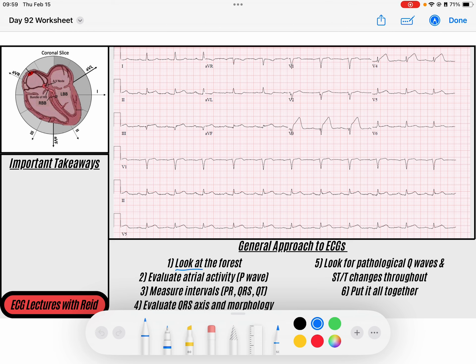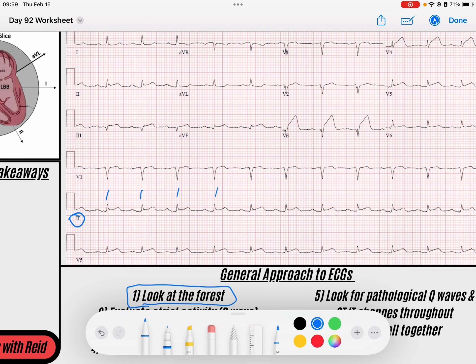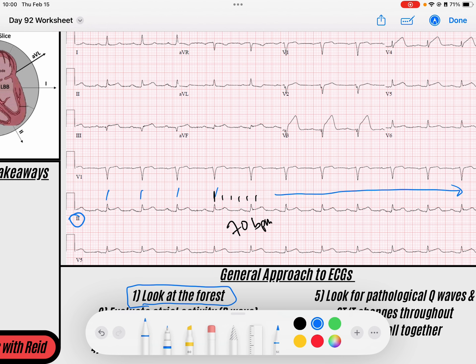The first thing I like to do is get an idea of what's going on with the rhythm — I call that looking at the forest, and the trees of the forest are my QRS complexes. Starting in lead 2, I see a narrow complex rhythm that seems to be pretty regular, occurring at a somewhat normal rate. I can calculate the rate by finding a QRS that lands on a solid line: 300, 150, 100, 75, 60 — somewhere between 60 and 75, we'll call this 70 beats per minute. Scanning through, we maintain this rhythm throughout the entire strip, and I can see P waves occurring in conjunction with my QRS complexes, which is reassuring.